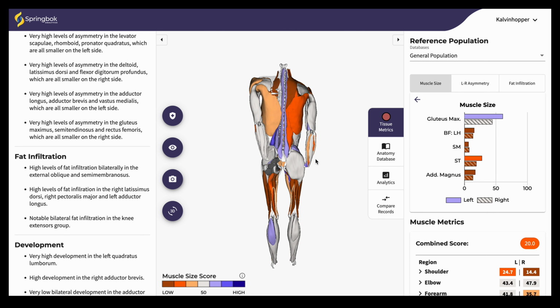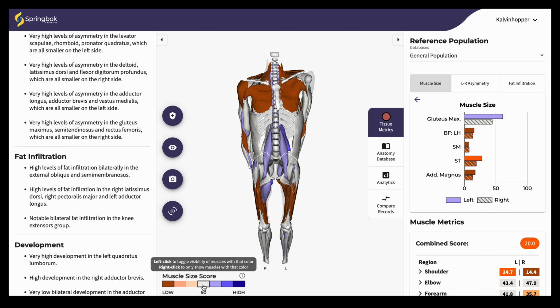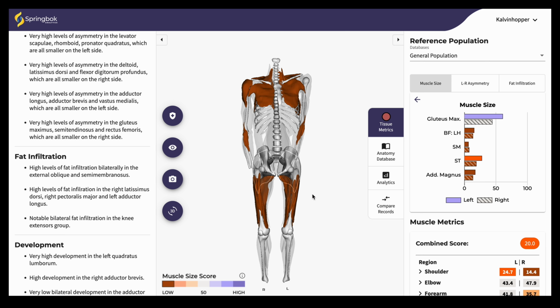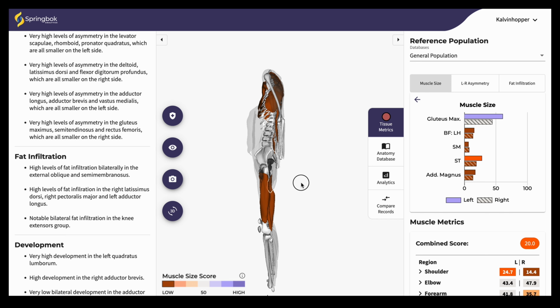Where is it though? Where's it at? It's gone. Ghost cheek. Okay, well there it is. So I can get rid of all the good ones and then leave what's bad, which to be fair is quite a large chunk. So upper legs, not huge. Check out those chicken legs. There's not heaps going on there.